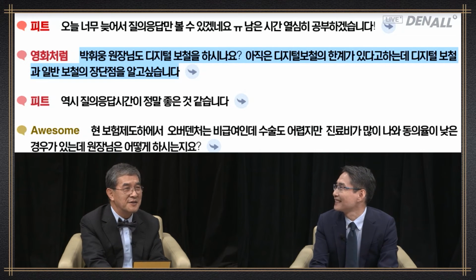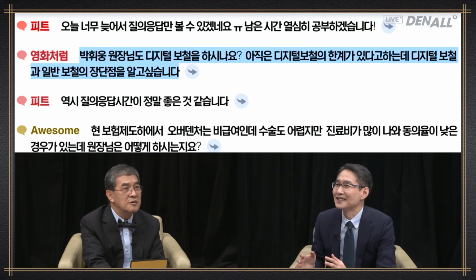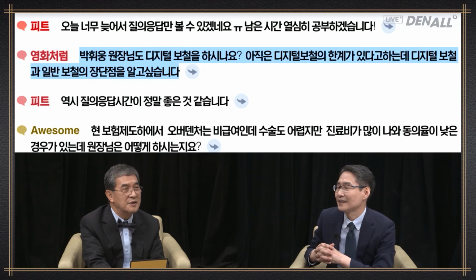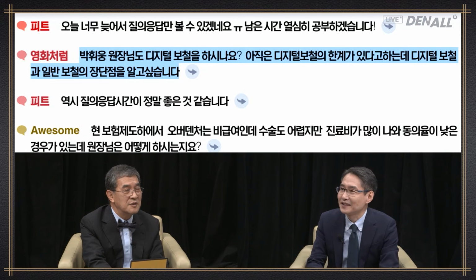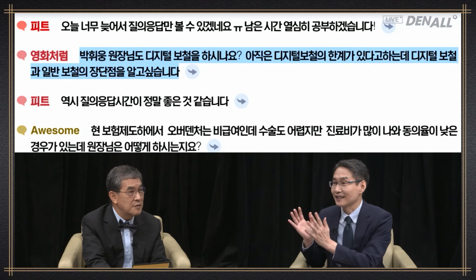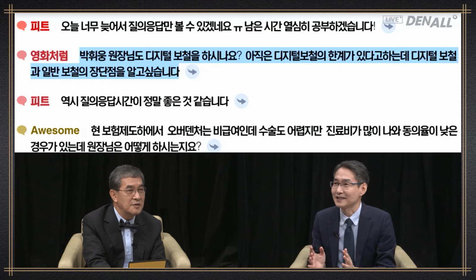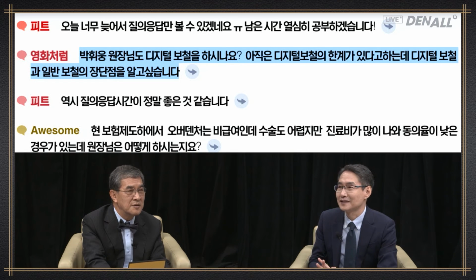In my dental clinic, I have most of the tools that the lab technicians use. However, my dental clinic is not fully digitized. It is to a level similar to a digitized lab. I don't use an intraoral scanner for final prosthesis, and I take impressions using silicone. And I make a model, and based on it, the lab technician uses a model scanner and creates the prosthesis using zirconia. I use intraoral scanners for provisionals.